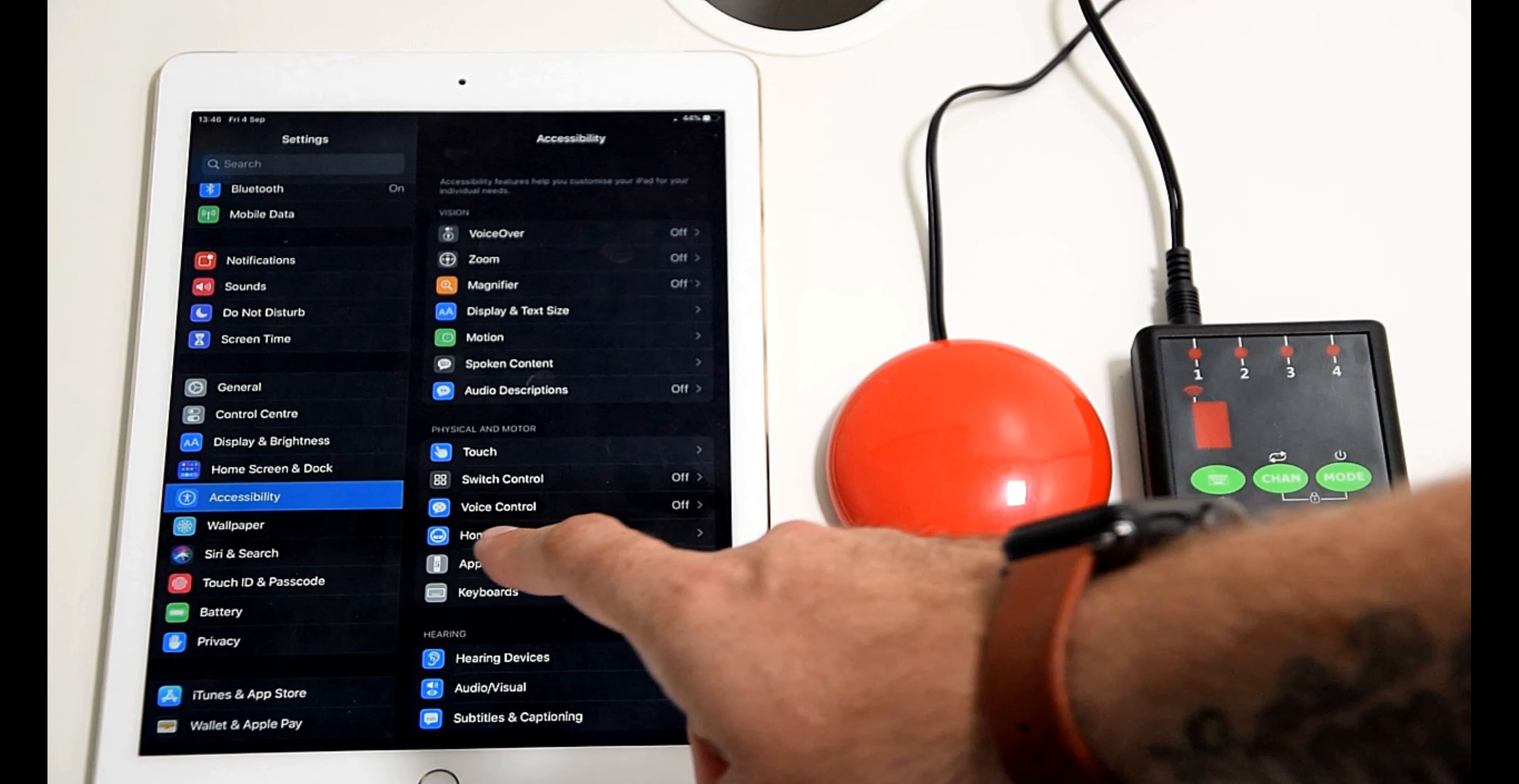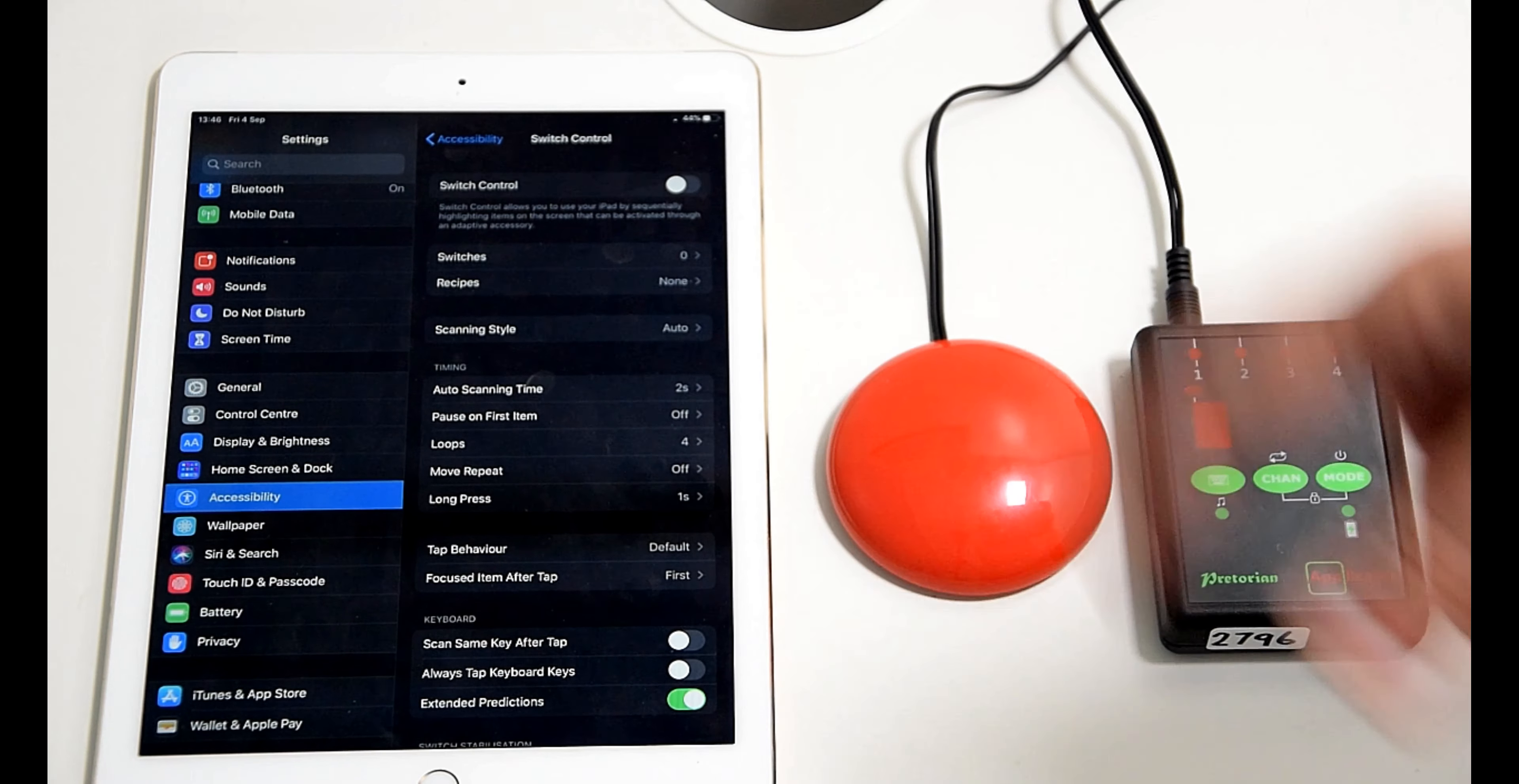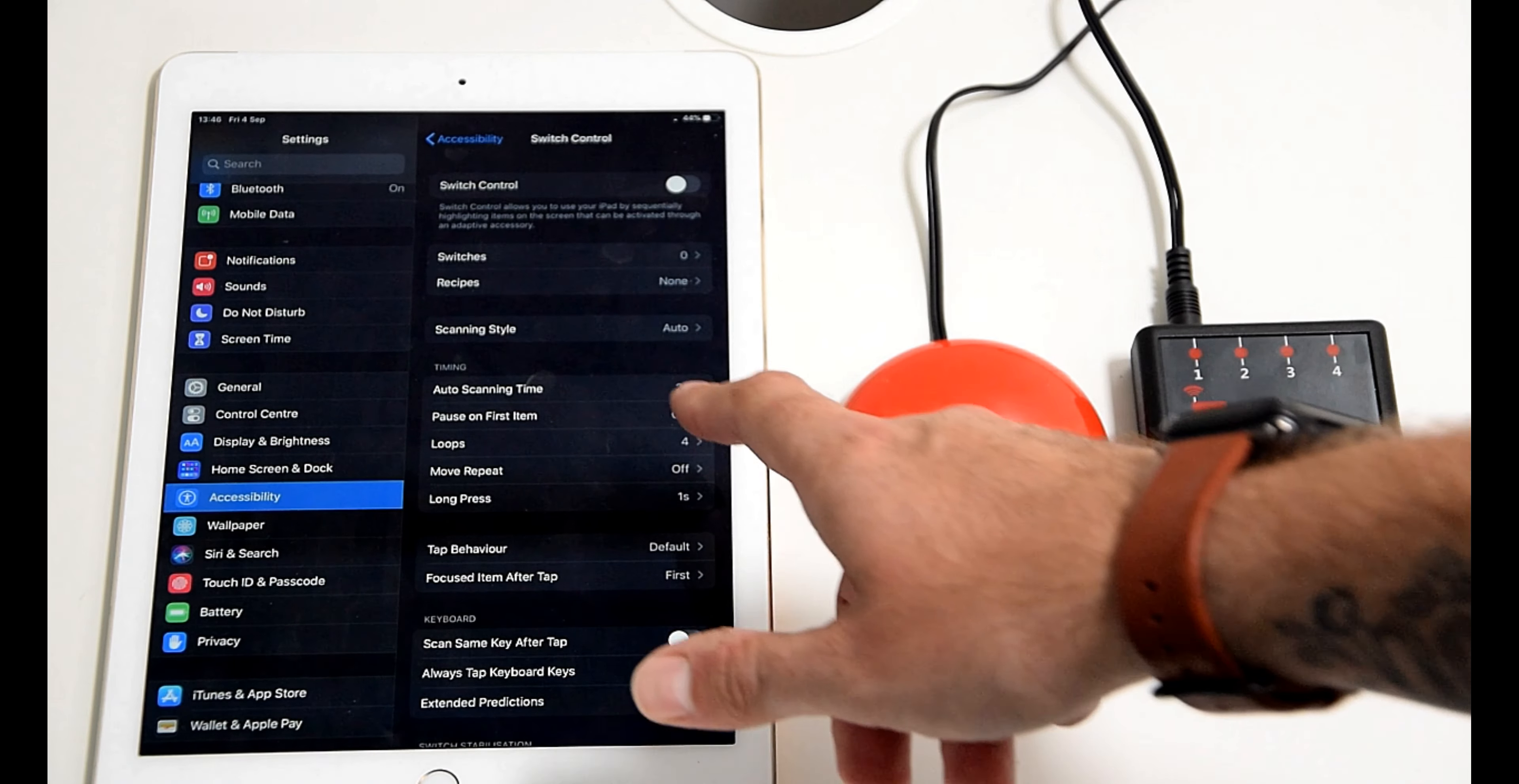So we'll dive straight in. We'll go into the switch control menu and you'll notice that I've cleared down all the switches. The applicator is on and still connected via Bluetooth.